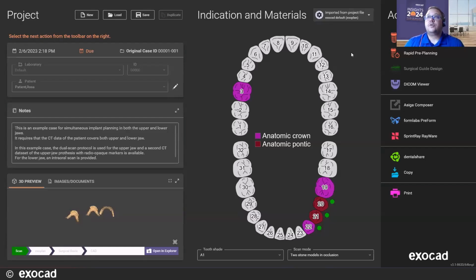That's a huge feature request. So for us to phase that in, the my.exocad account has been implemented for all end users to create their own account. So that's the first phase, and as we move forward, we'll provide a dongle-less solution. So that's where we're headed.